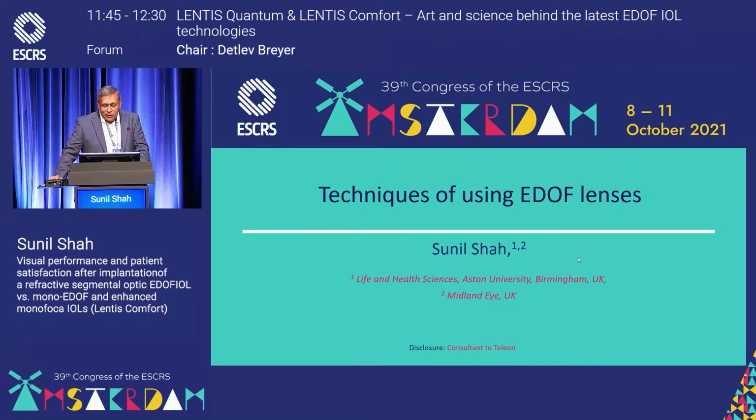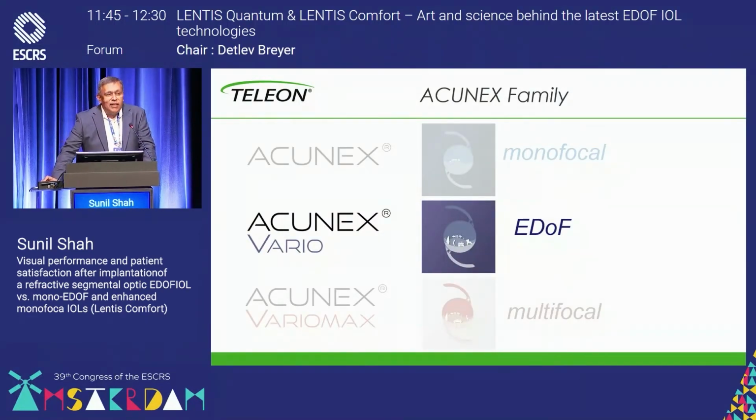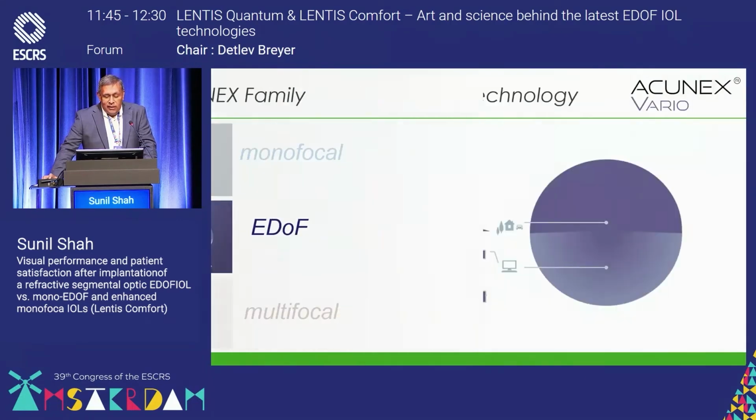Sunil. Thank you. So I'm actually going to talk a little bit differently, just about ideas on how you can utilize EDOF lenses to give you the best possible results. As you know, within the Acunex family, there are monofocals, there are multifocals, and we're talking about the group in between, the EDOF lens. And really it's to see whether we can give you some ideas when you should perhaps use these.